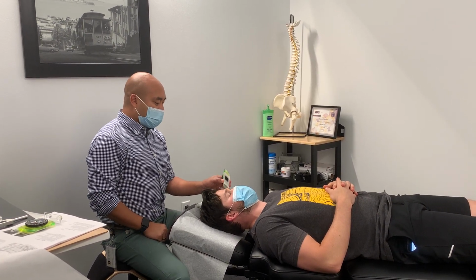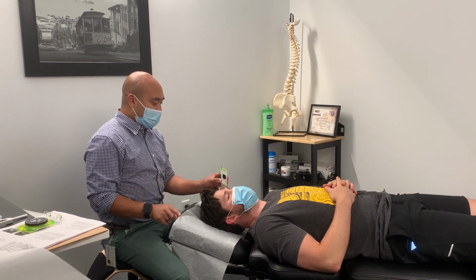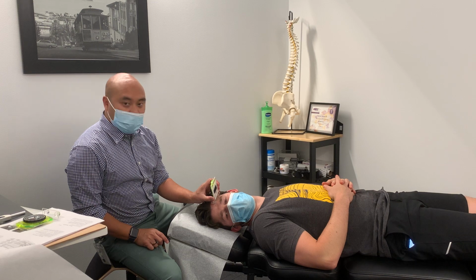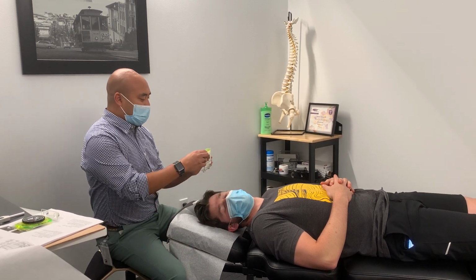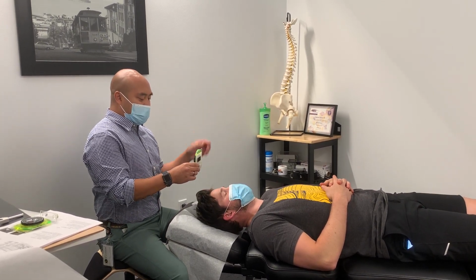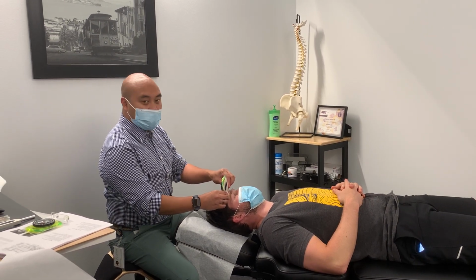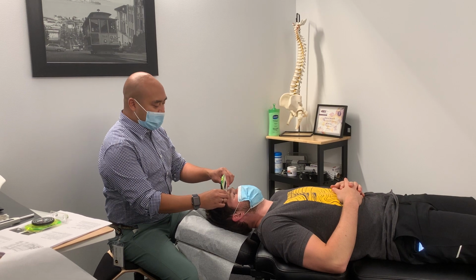So for rotation to the right, I'll have him rotate to the right, and I'll carry and stabilize the inclinometer with him. And I'll note the range of motion there. Zero it out. And then for left rotation, I'll put it above the right eyebrow, stabilize it there, not pressing too hard, but pressing gently and firmly.